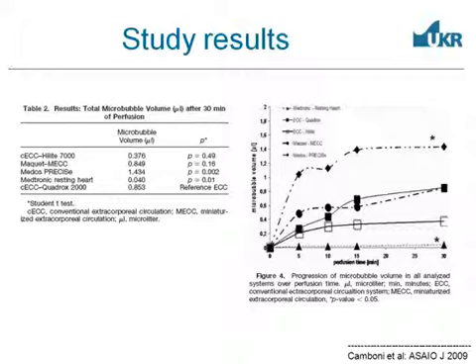As a consequence of that, we saw quite surprising results. You see here the standard ECC is the Quadrox here. The standard ECC is just in the midline.